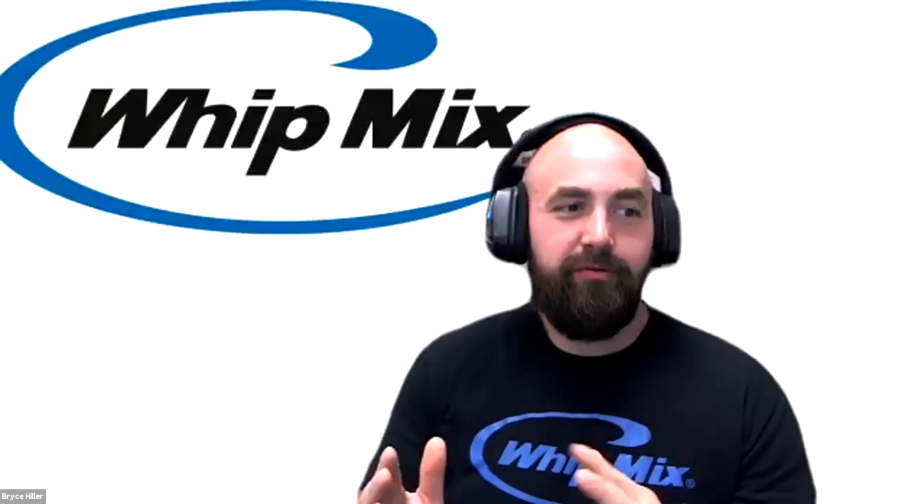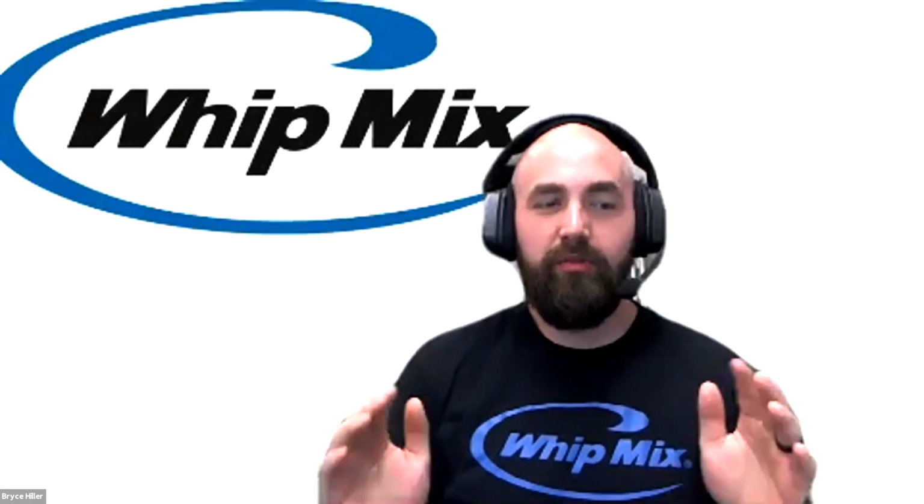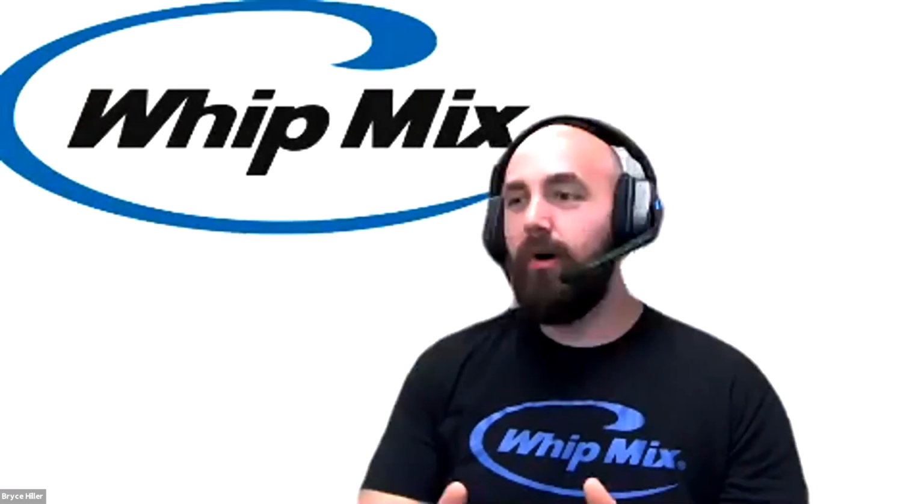Coming at you for the week of May 25th. We are going to be doing removable partial dentures 101 this week.